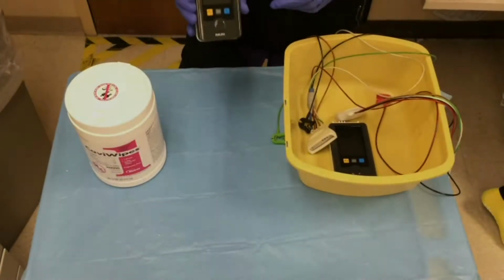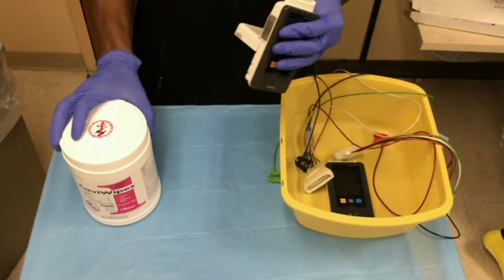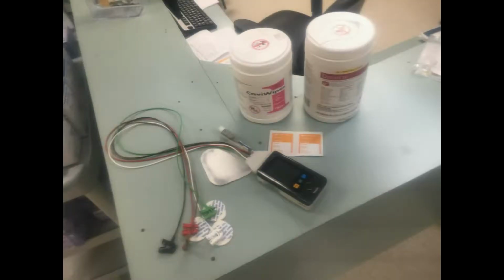This video will demonstrate how to effectively and safely clean a telemetry monitor. First, you want to make sure you are using the proper disinfectant for the box. Any patients that are on special isolation precautions or C. diff precautions, you want to make sure you use Dispatch or a hospital-approved bleaching agent instead of the Cavicide wipes. All other cases only require Cavicide.